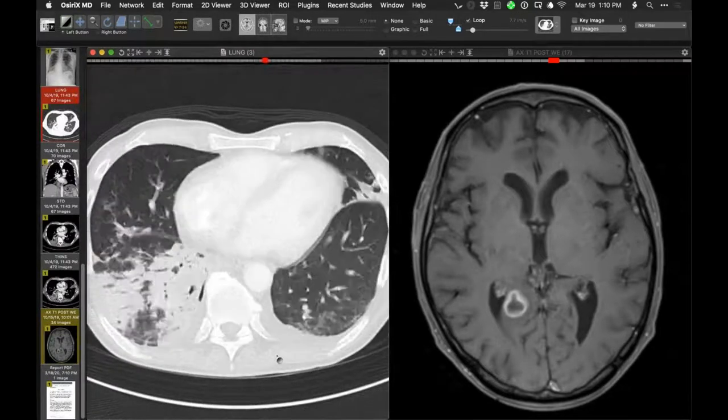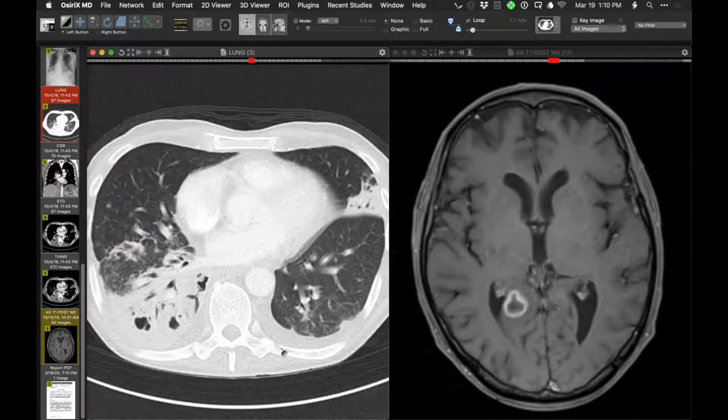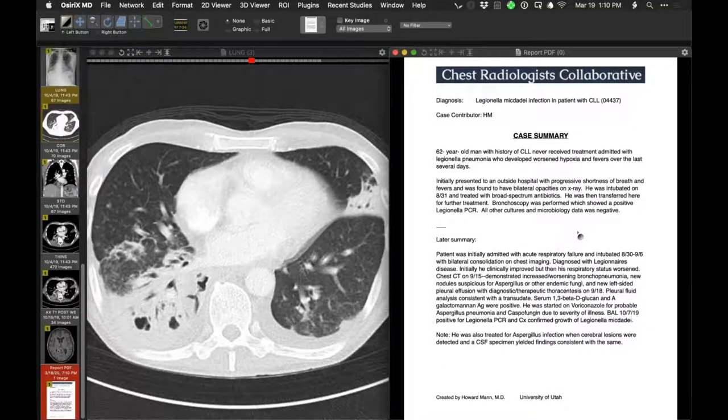And Legionella is, you know, if you have a pneumonia that presents bilaterally, Legionella ought to be on your list. When you have bilaterality at presentation. So this fits with that maxim. And then it can be a dense consolidation, it can be ground glass, it can be small airways kind of stuff too. So it's just a real spectrum.